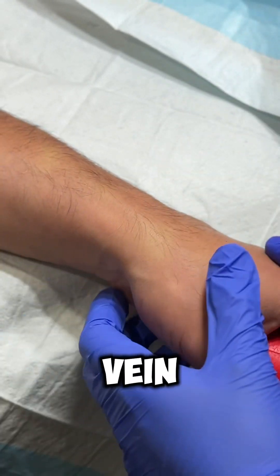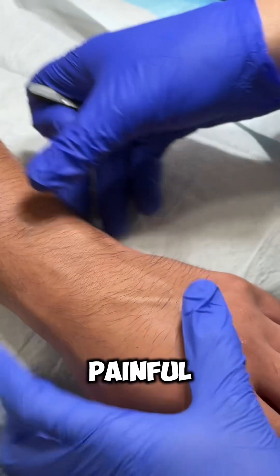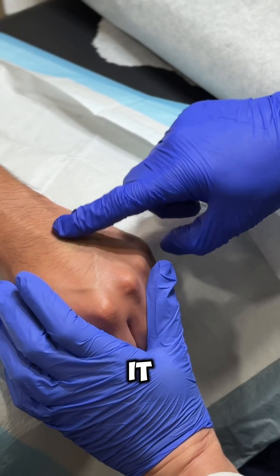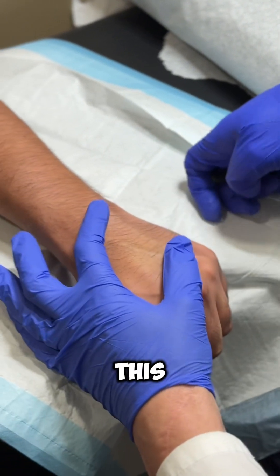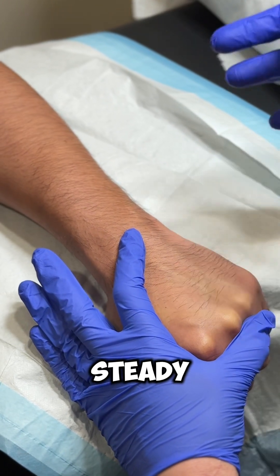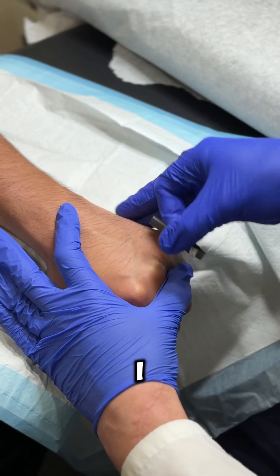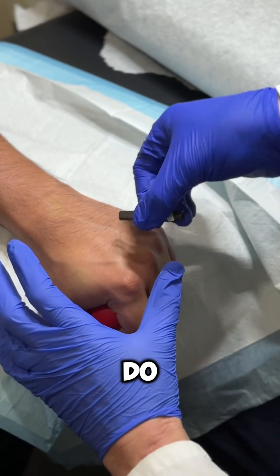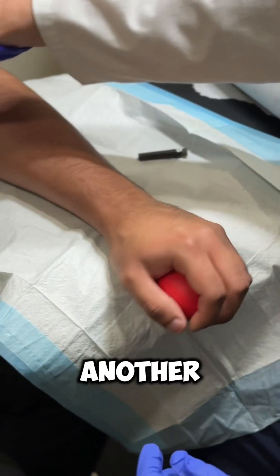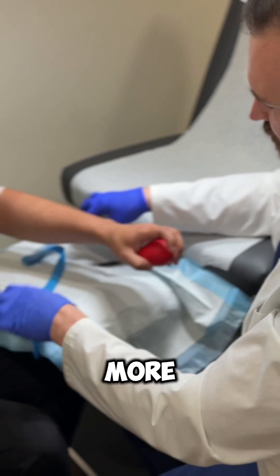As a last resort we can use the hand veins — hands are more painful. In hospital settings we go from the hand upward, even though it's more painful. See how much the vein moves when I touch it? I'm going to put it tight and go in steady, supporting my needle on something. If I don't support it I'm going to miss it. We can also do one more with a butterfly on the hand.